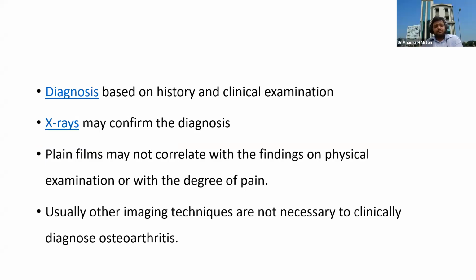So diagnosis by X-ray is a very important part. You can classify it as type 1, 2, 3 or 4, or as advanced osteoarthritis or not. Also consider ultrasound, because when you put the ultrasound on, you can find not only the bony changes but also other changes, like ligament changes or meniscus changes, tendinopathy or tendinosis, bursitis, or a collection. And then you can tell whether this collection is inflammatory or non-inflammatory.